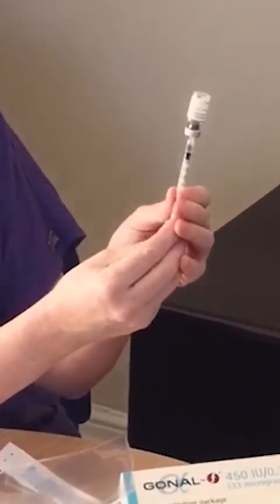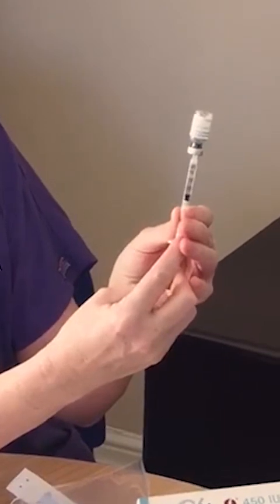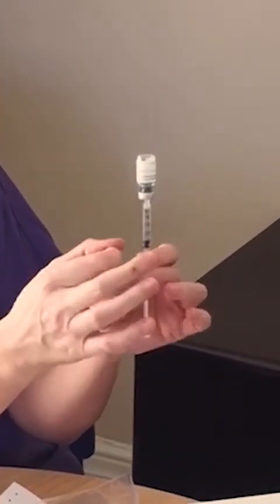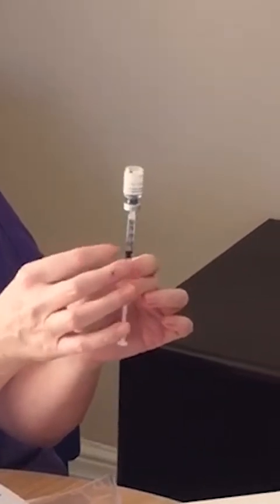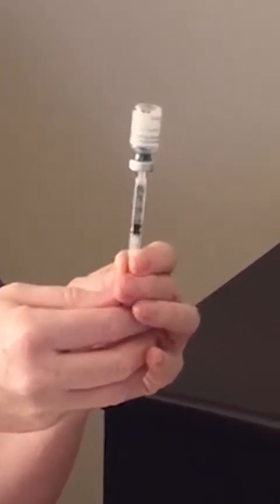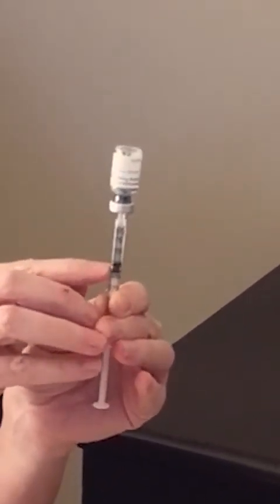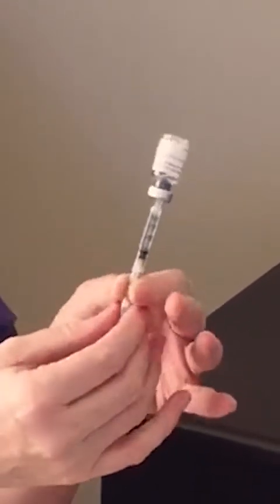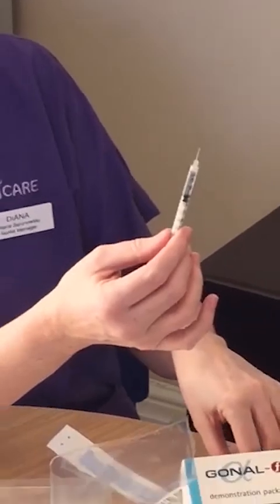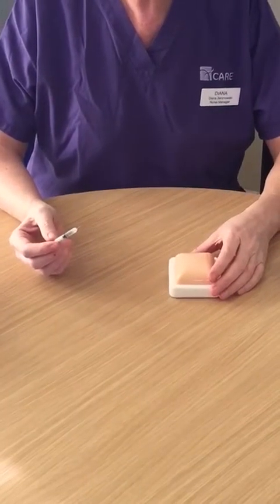Pull down on your syringe and we would recommend you go slightly past your dose. Tap your syringe so that any air bubbles come back up, and then push so that the top of the black syringe bung here is in line with the dose. You are now ready to administer your dose of Gonal-F.